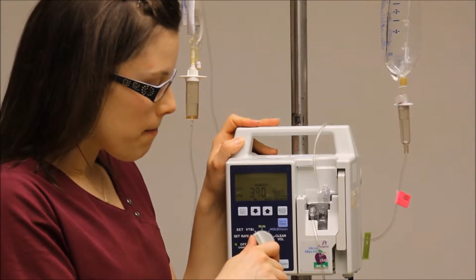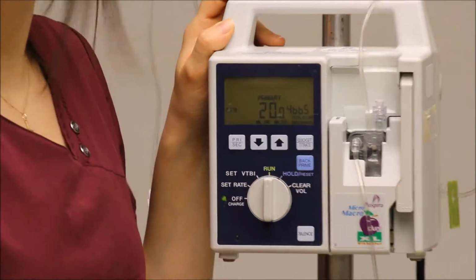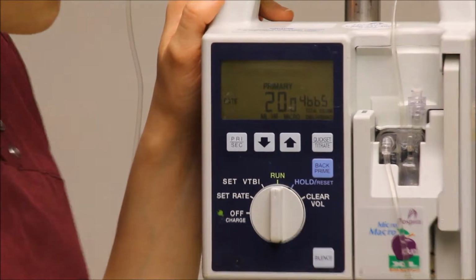So after you do that, it's set and ready to go. You just go back to run, and it's good to go. It's infusing into the patient.